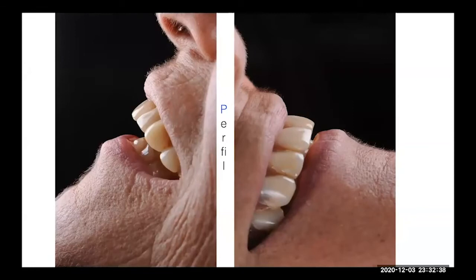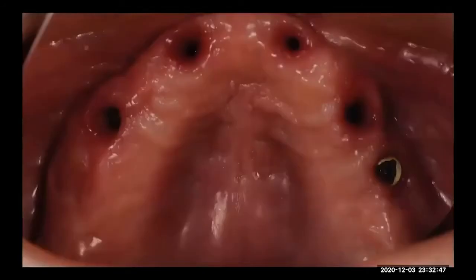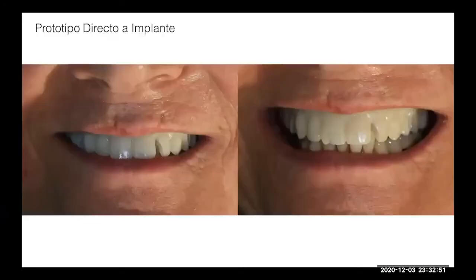This is something really, really important. We can apply the technique in different ways. So this is the way that we receive this patient. He did the impression directly to the implant.